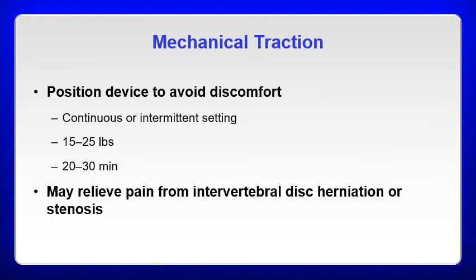And I have on here 20 to 30 minutes. You could be 10 to 30 minutes. A 10-minute treatment is fine as well. So you can mark that off and just put 10 to 30 minutes. And again, this can relieve pain from intervertebral disc herniation or stenosis.